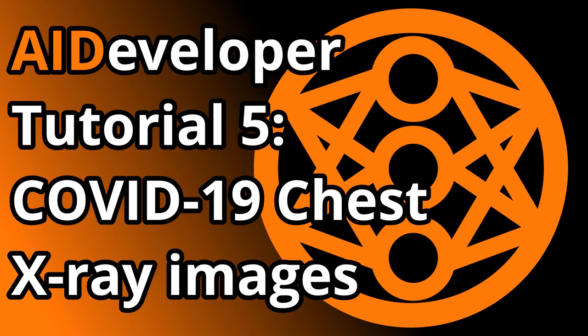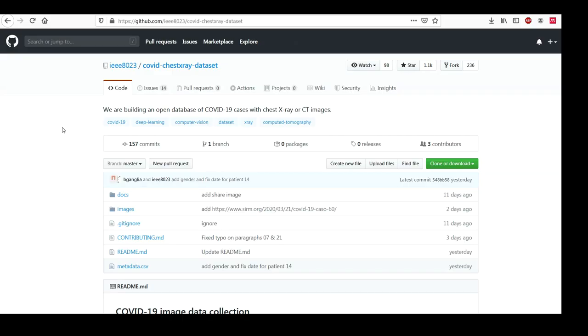Hello, in this video I want to show you how you can detect COVID-19 from chest X-ray images.